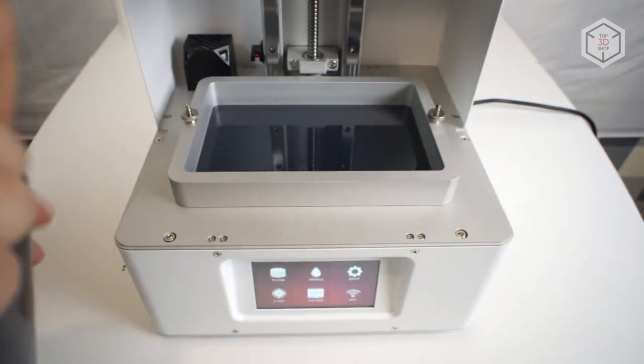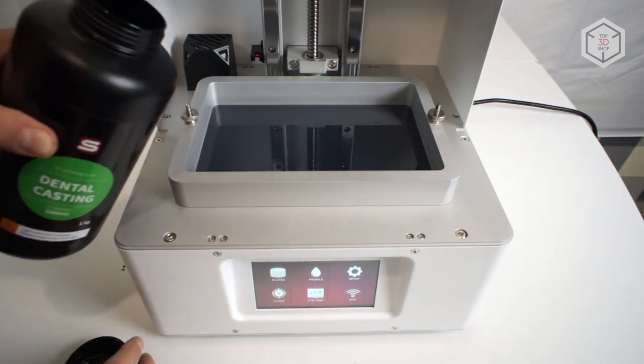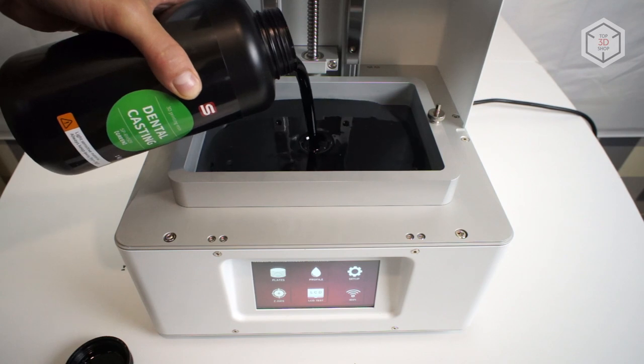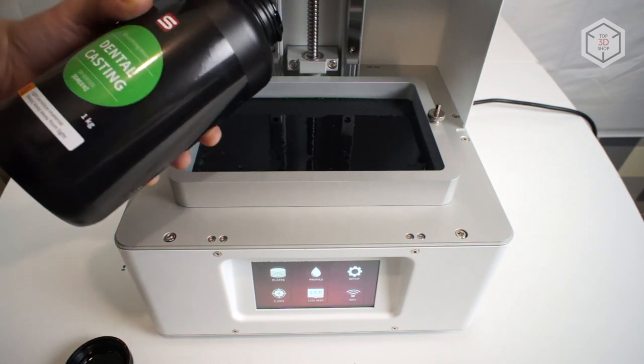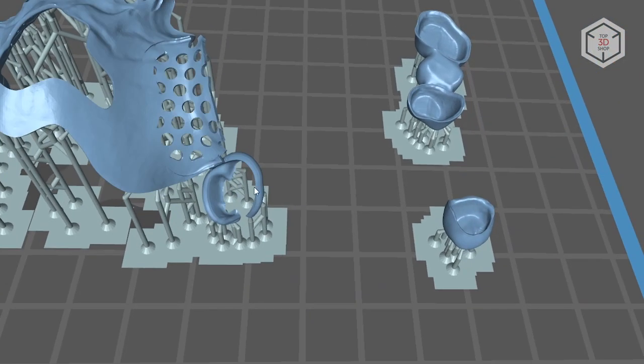Next, we decided to print several models with Sprint Ray Dental Casting Resin. Such consumables are utilized to print parts which are then used to create molds and cast with molten metal. The advantage of such specialized resins is that when burned out, they leave almost no ash residue. For this test, a clasp prosthesis, a crown, and a bridge were placed on the build plate.